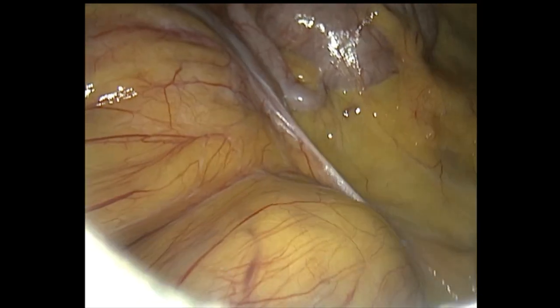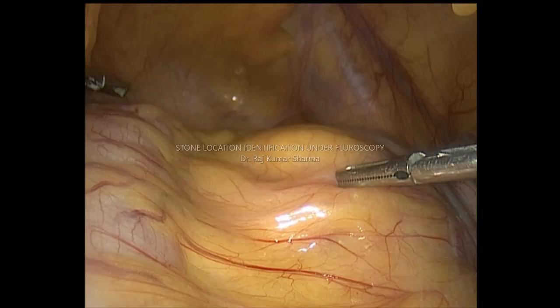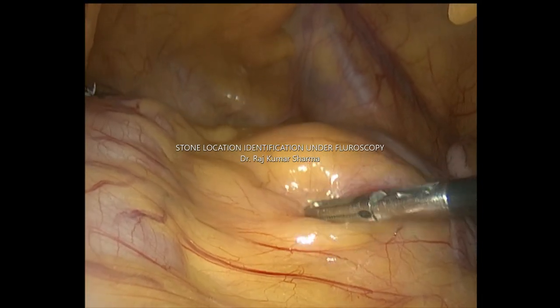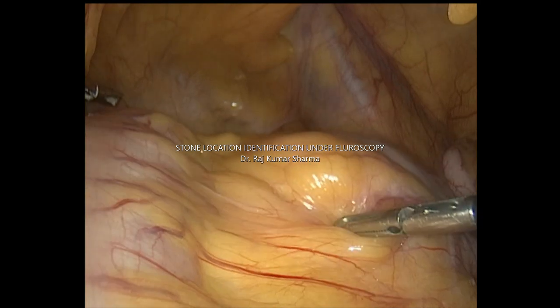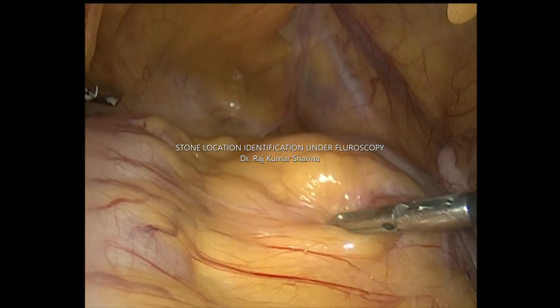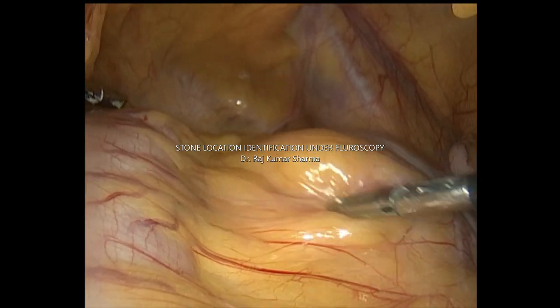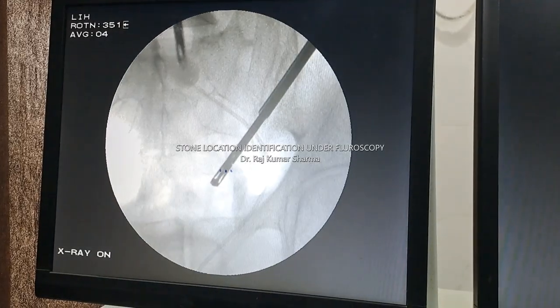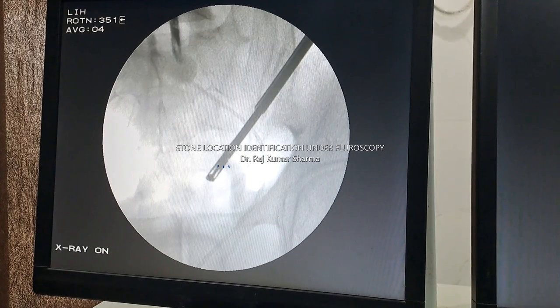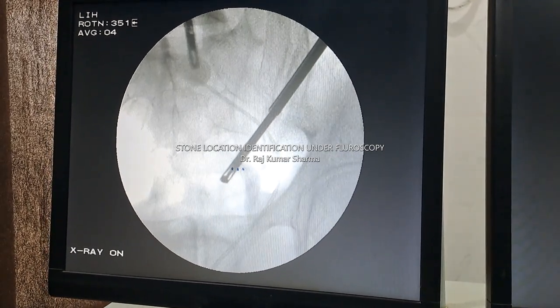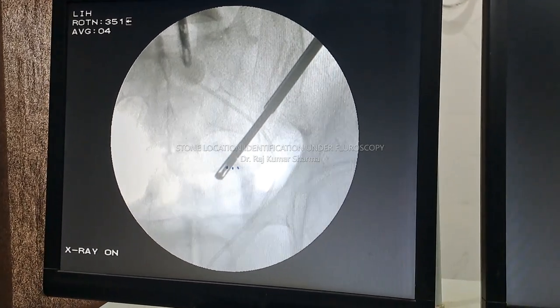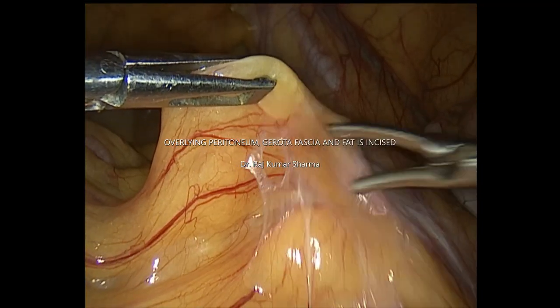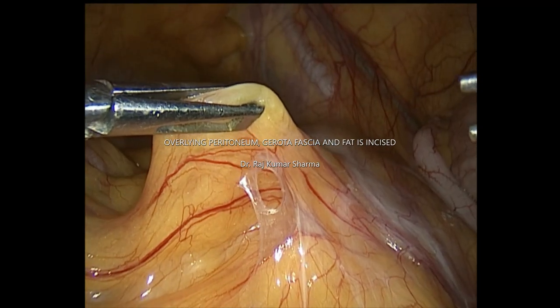The next step is stone location identification under fluoroscopy. This is how the stone is located so that we can proceed further by removing the overlying peritoneum, Gerota's fascia, and fat.